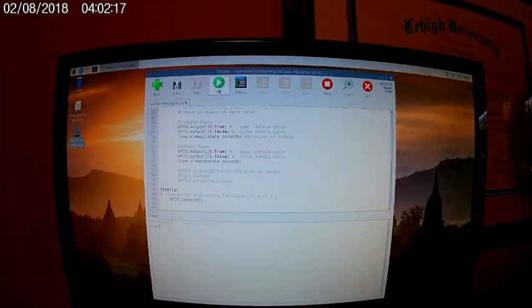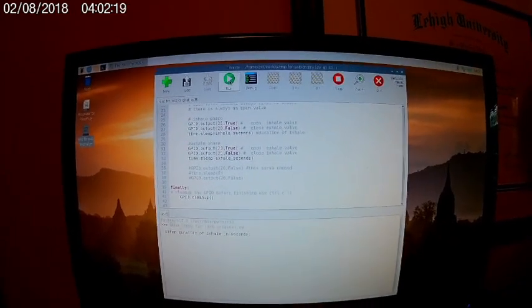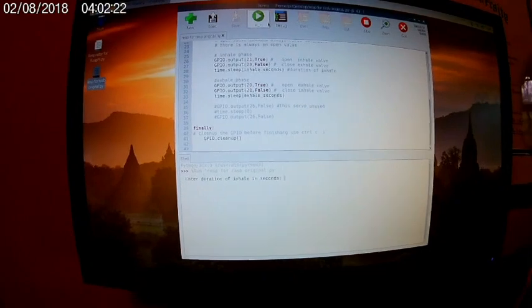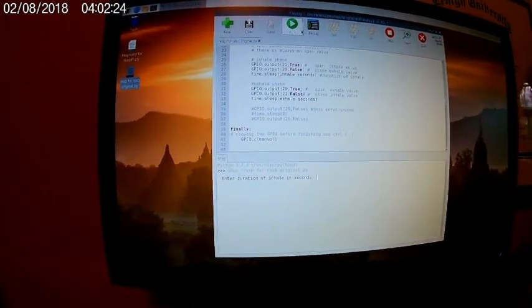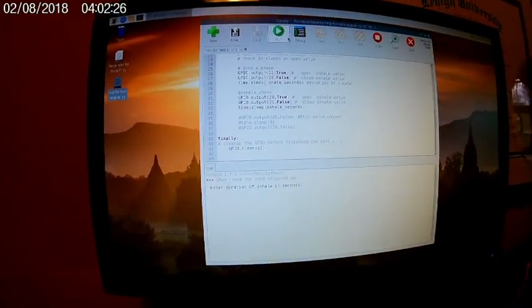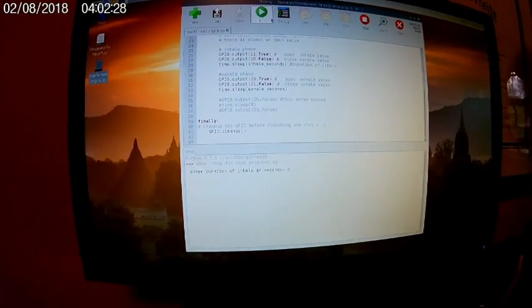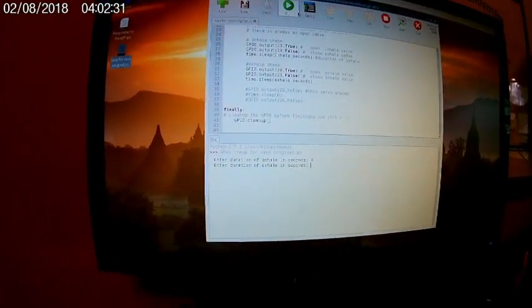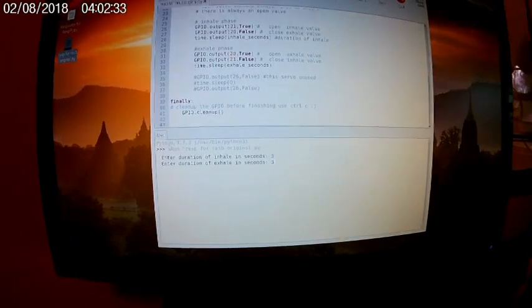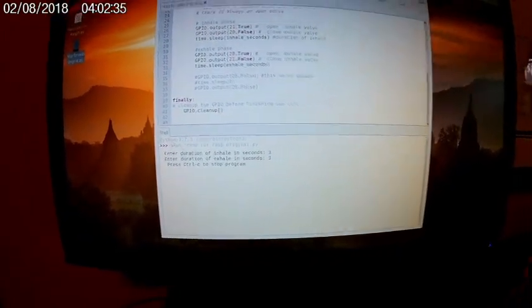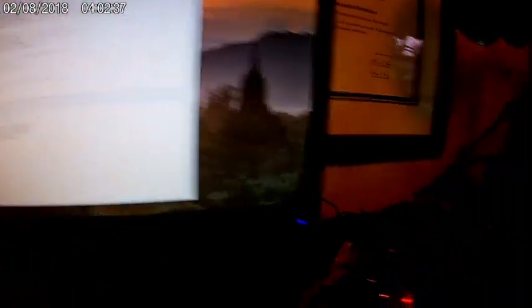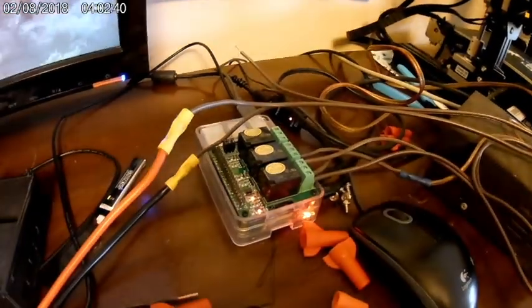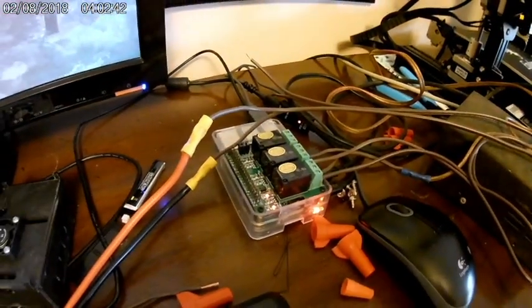Just as an example, you run the program. Enter duration of inhale - let's say two, three seconds. Enter duration of exhale - we'll say three seconds. And you'll see that once you do that, the servos that open and close the valves cycle every three seconds.